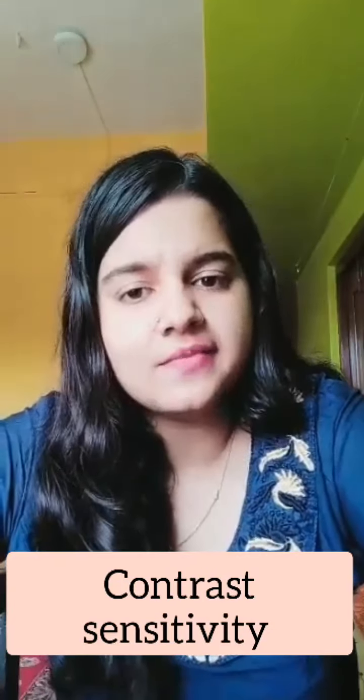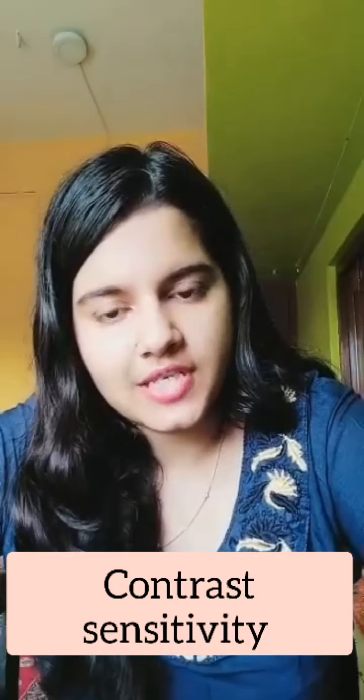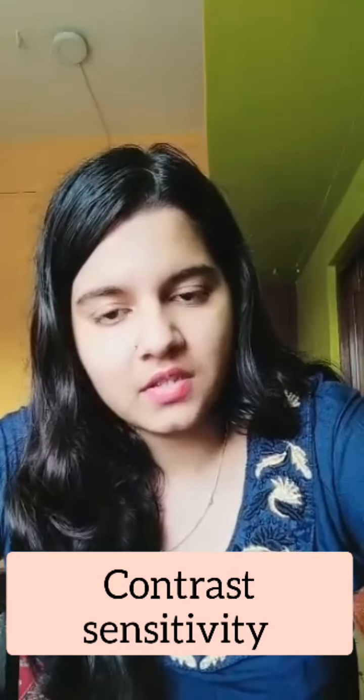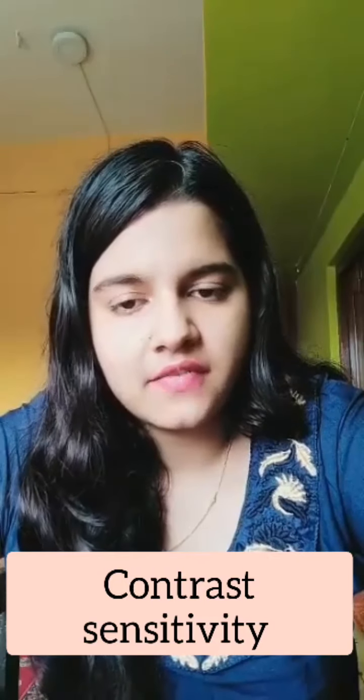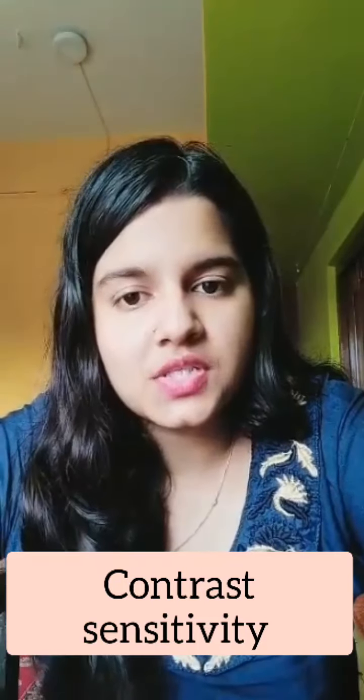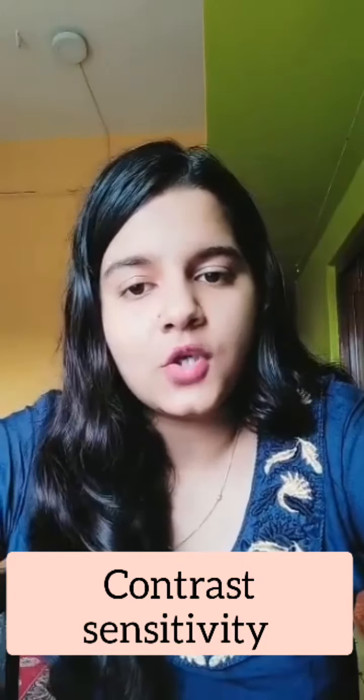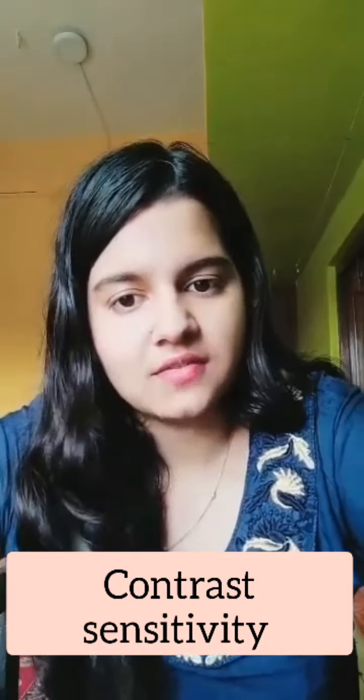Now we'll be moving towards the contrast sensitivity part. This basically helps us to see objects in very low contrast. This affects our day-to-day life if there is a problem in contrast sensitivity. And checking for contrast sensitivity is important, as it helps us to decide what kind of low vision aids should be given. Basically, we use the Pelli-Robson chart for the testing of contrast.